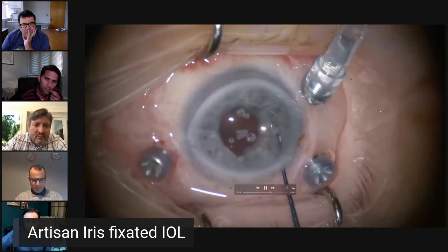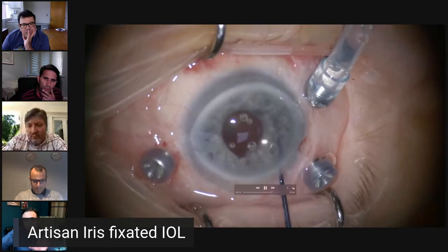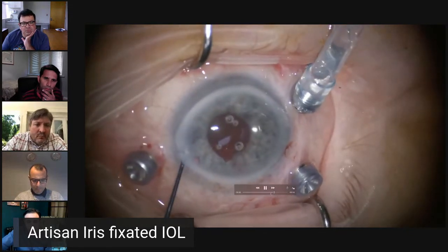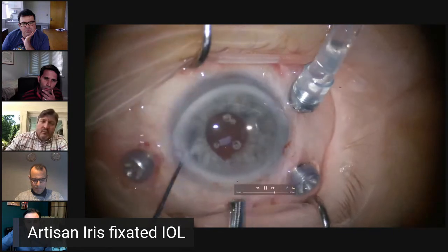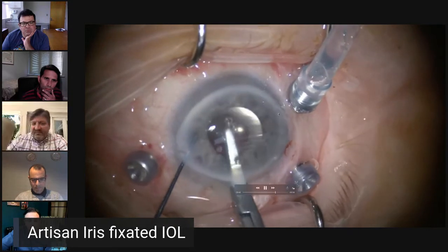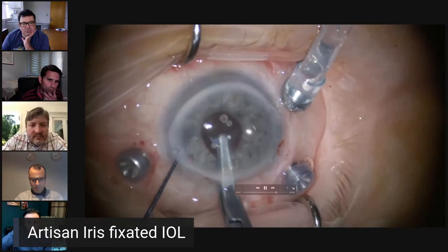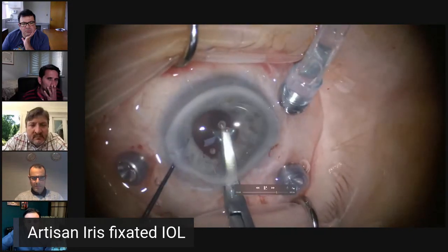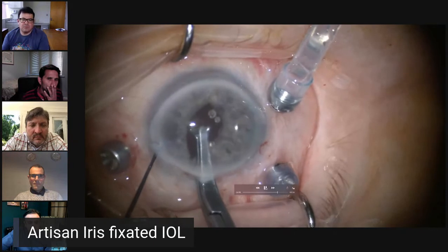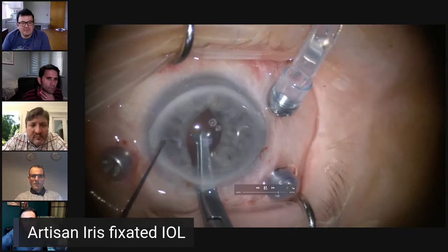Sometimes you have iris missing, so you can find the areas where the iris is the chunkiest and most stable. And basically, we introduce the second instrument first to avoid collapsing. At this stage, the infusion is off, and you rotate, pick up the lens near the haptic that you're going to clip and lift, then push it behind the iris, and then you lift it up to have an imprint on the iris, and then you basically have to use some imagination as well as seeing where the haptic is and hook it. All this comes with experience.